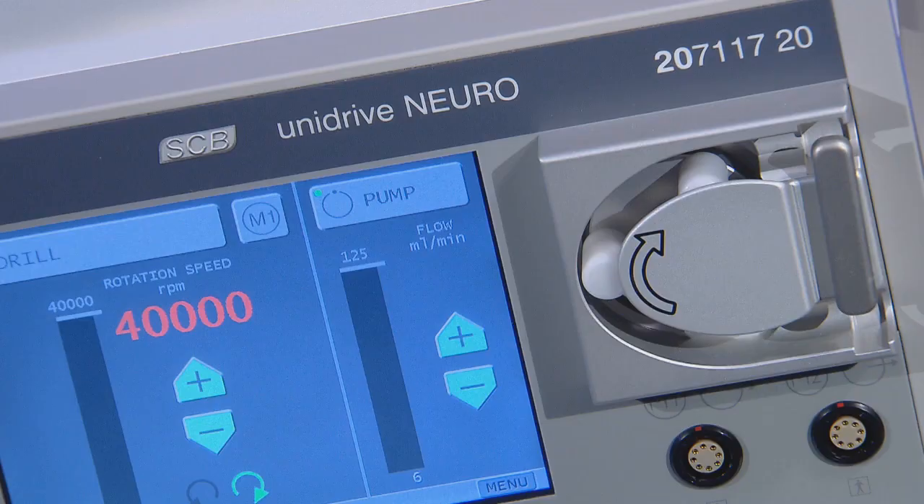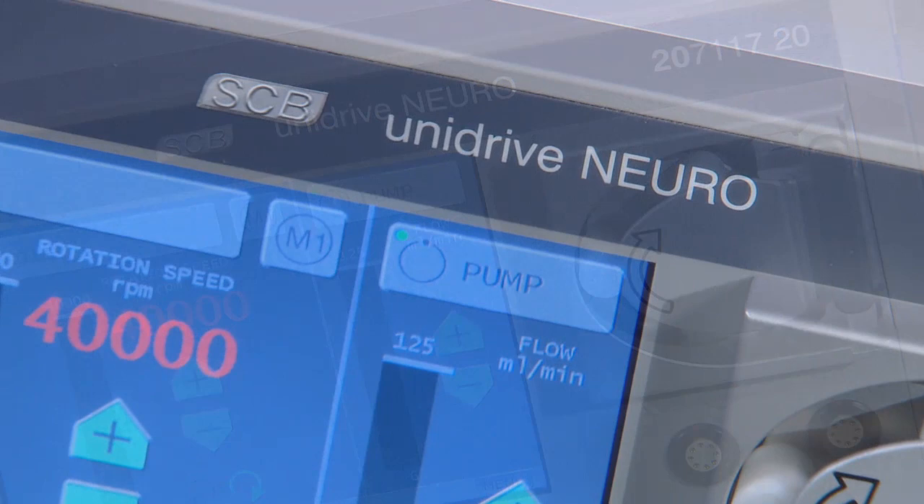Drill procedures are controlled by the UniDrive Neuro system, which features continuously adjustable speed of rotation through a touchscreen and microprocessor-controlled motor speed with two simultaneous connections of two motors.